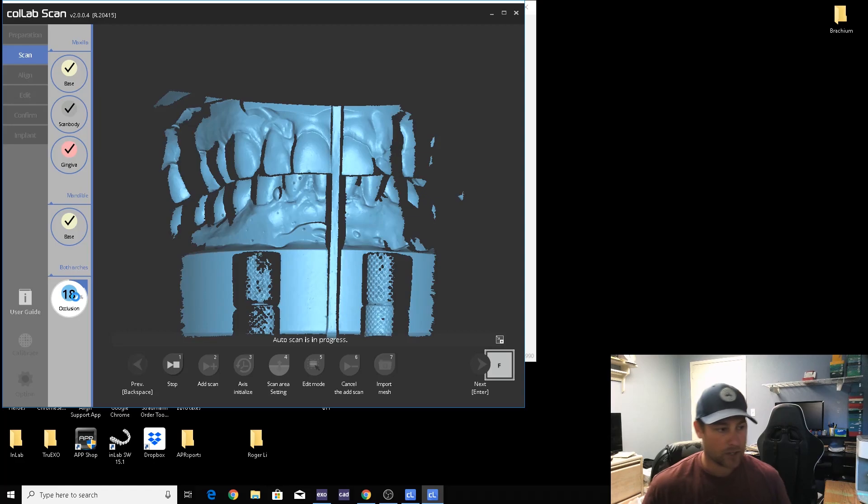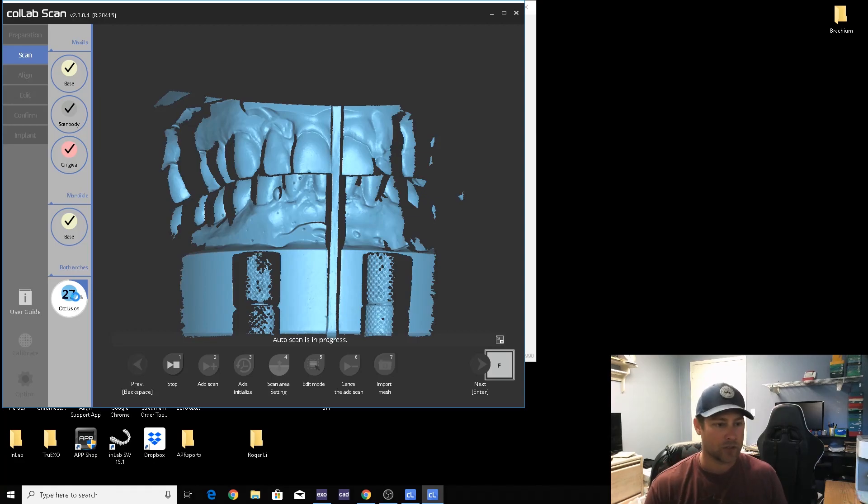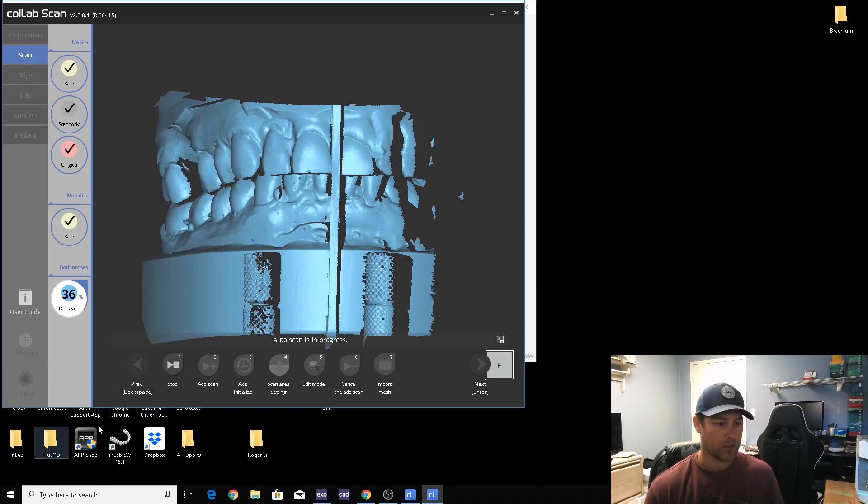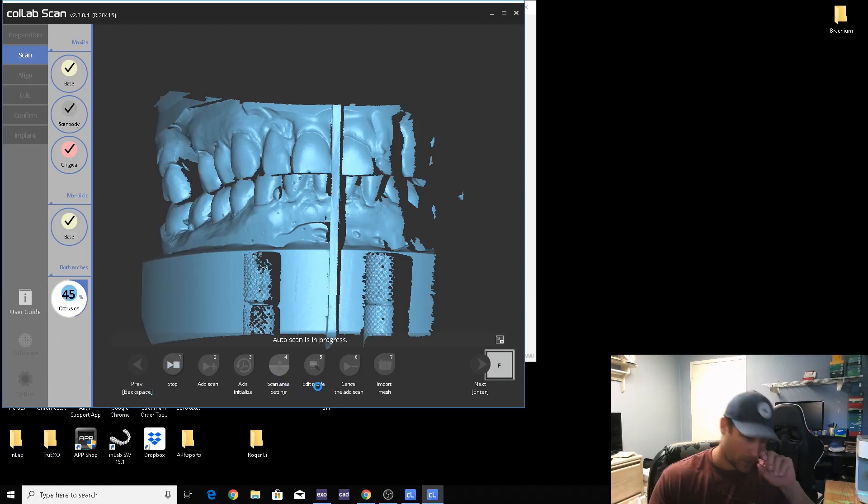The last thing we've got to do is align everything up as soon as it gets done taking the bite. That's enough for a bite. I'm just going to go ahead and stop it, speed it along a little bit.